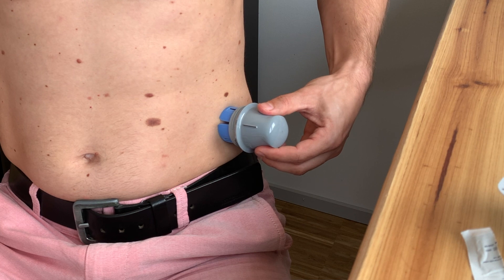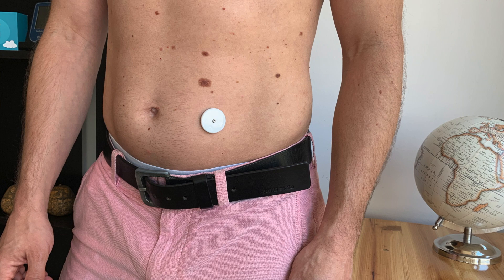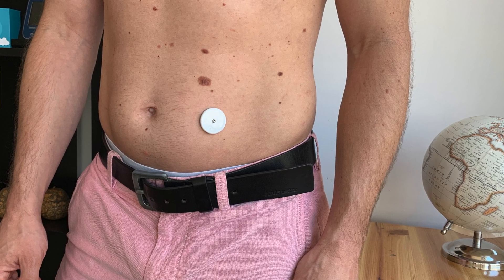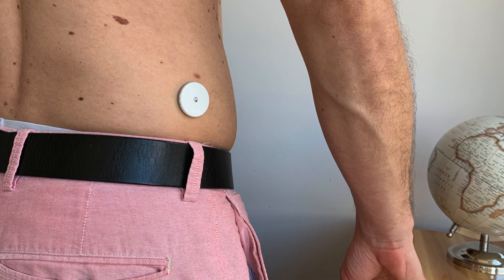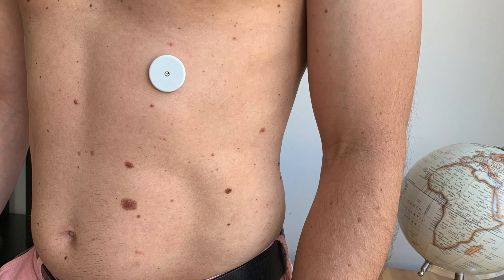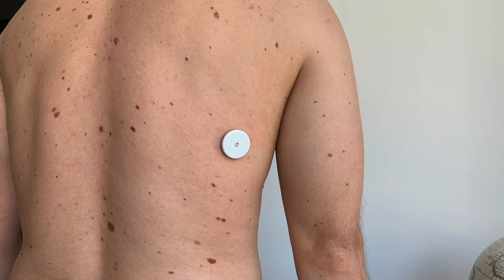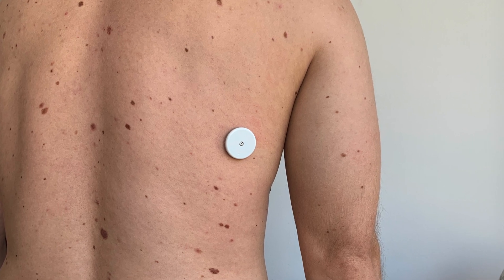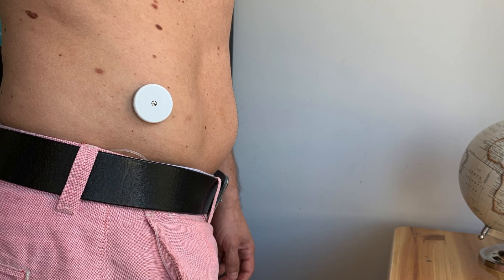I also asked other users in various Facebook groups where on the abdomen area they placed their sensors. I found a huge variety of options, starting from the belly and love handles going all the way to the upper side section of the abdomen, and some users even put the sensor on their back. You can see all the possible spots in the pictures on the screen. I was most comfortable with the hips because I thought this area is probably the safest — based purely on gut feeling. I did not have any issues with the hips from a placement or removal perspective because I find this area is easily reachable.